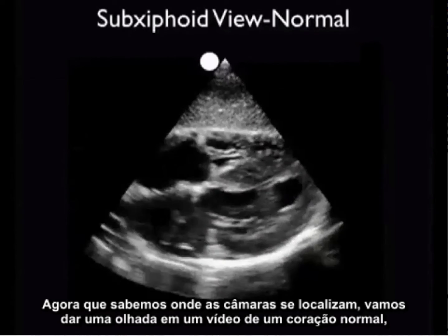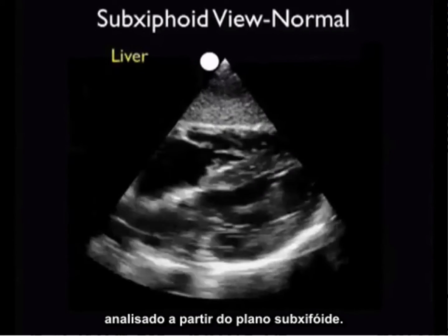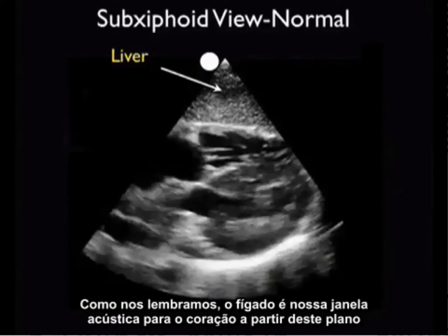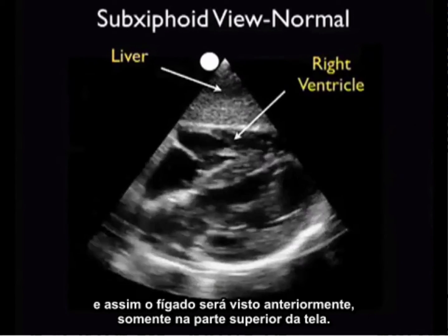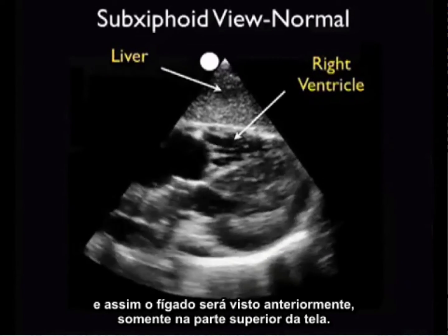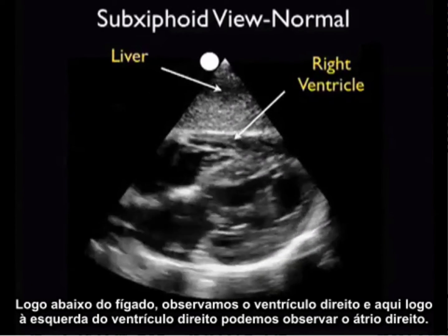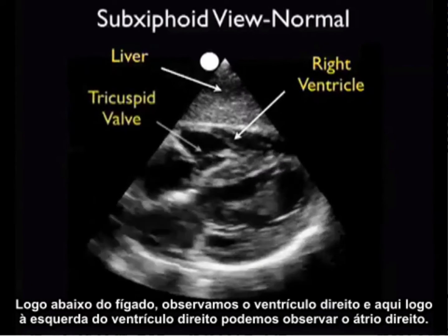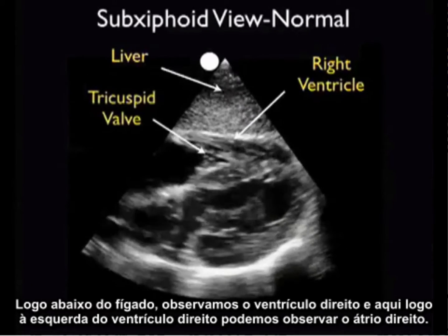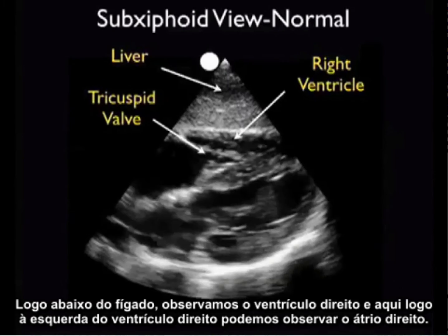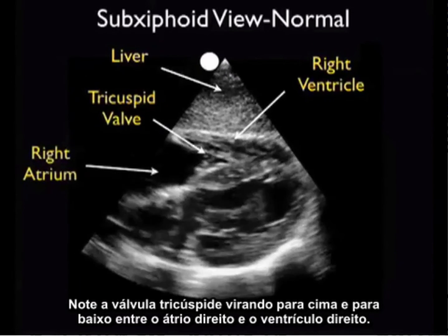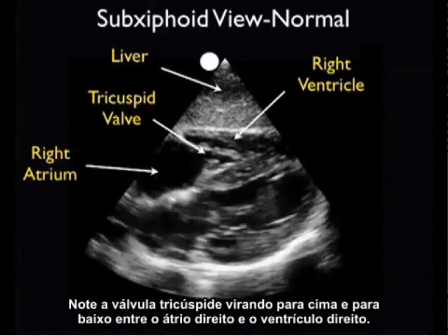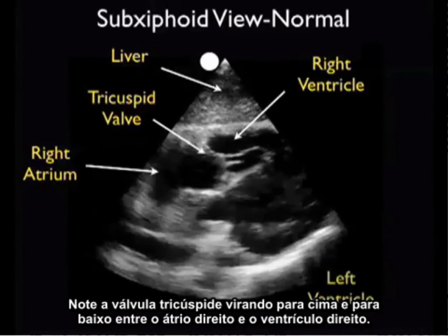Now that we know where the chambers are, let's take a look at a video clip of a normal heart from the subxiphoid plane. The liver is our acoustic window onto the heart from this plane, so the liver will be seen anteriorly at the top of the screen. Just below the liver, we appreciate the right ventricle. And just to the left of the right ventricle, we can appreciate the right atrium. Notice the tricuspid valve flipping up and down in between the right atrium and the right ventricle.